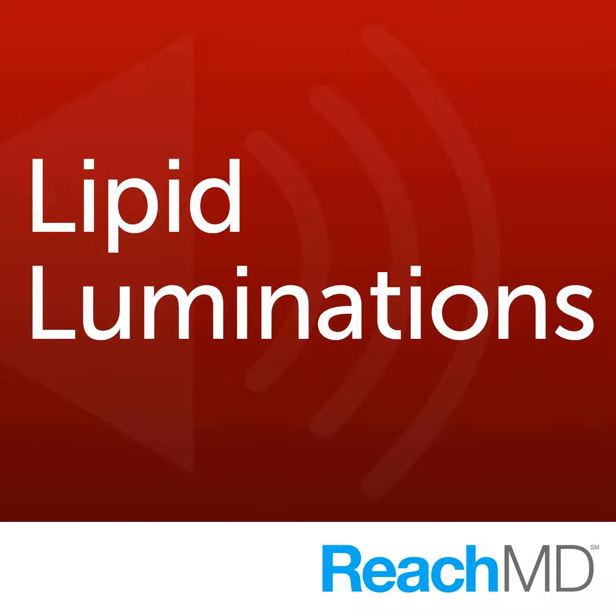But getting back to your question about plaque, it's true that's not carotid IMT measurement, but if you combine carotid IMT measurement with finding a plaque in the carotid artery at the same time, that actually improves your risk assessment of the patient. That's been shown in studies where carotid IMT has incremental value over traditional risk factors, and carotid IMT plus plaque evaluation has even more incremental value over traditional risk factors.